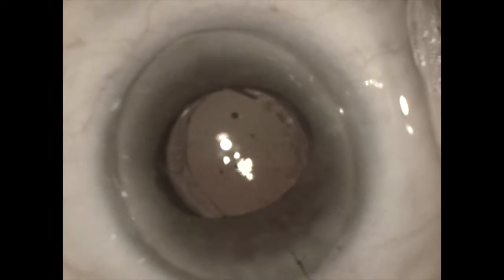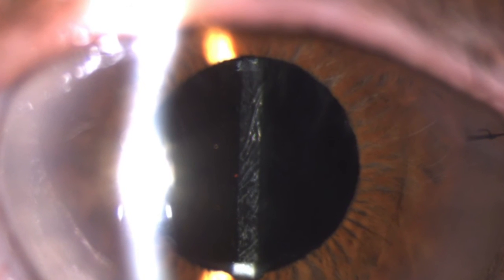The stability of the lens is tested with a Sinski hook and found to be excellent, and the case is completed. Here is an image of the patient at the slit lamp the next day in the office.